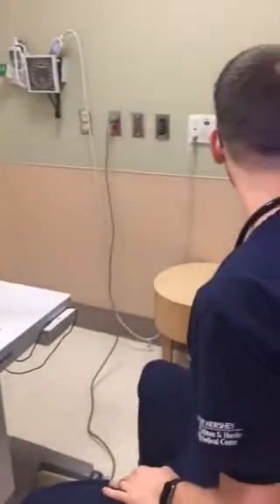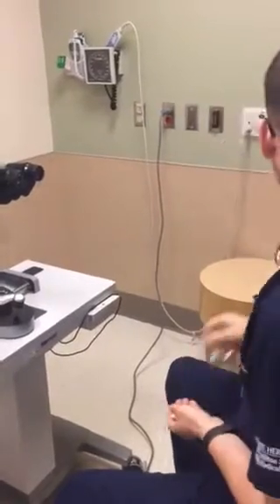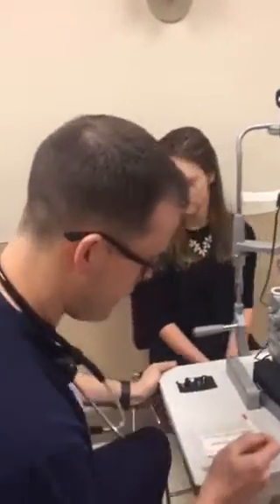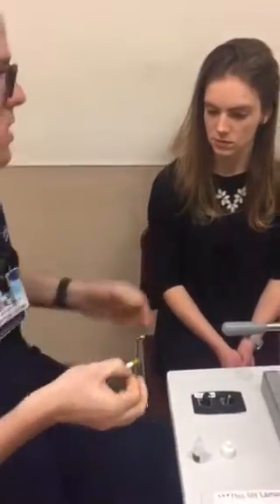What we're going to do now is go ahead and do the drops and the fluorescein stain for the eye to be examined. I like to do the drop and the fluorescein in one step — it just saves a little time. Put a drop right there, tilt your head back. This might sting a little bit but it won't last very long. Okay, blink. Good, we've got that done.